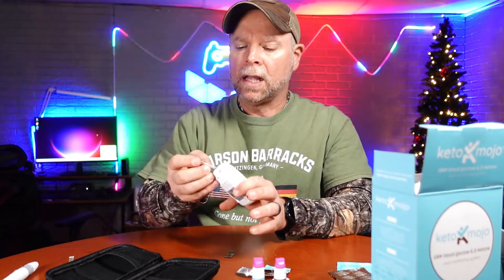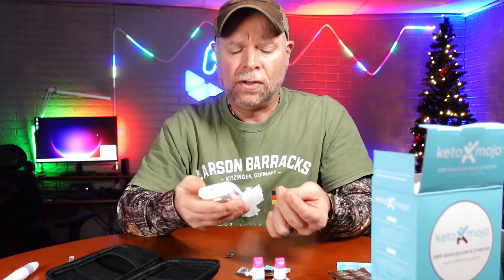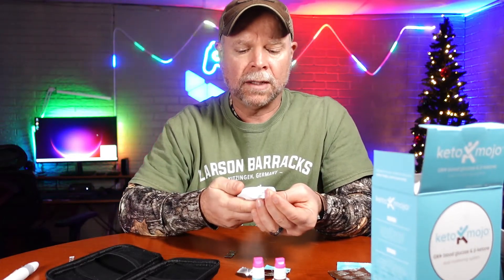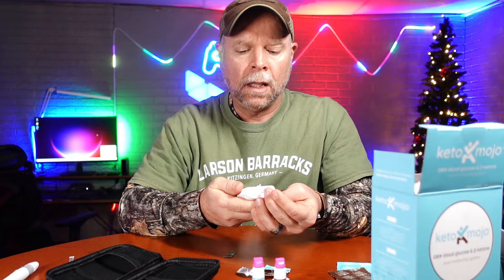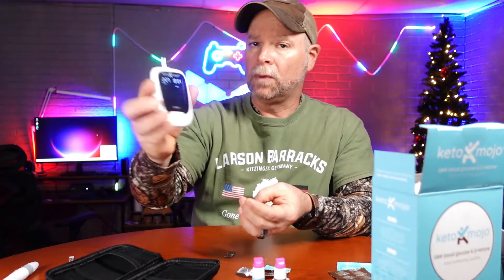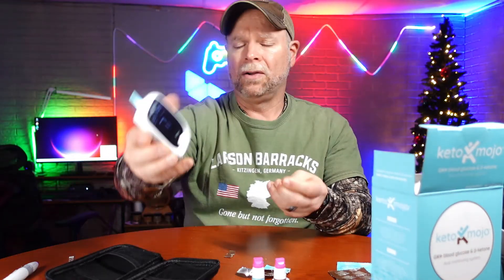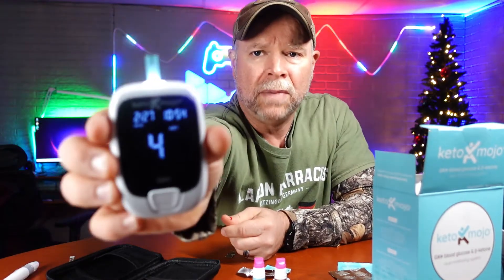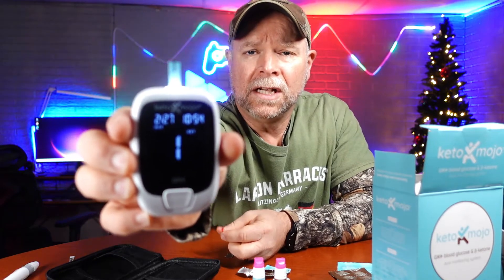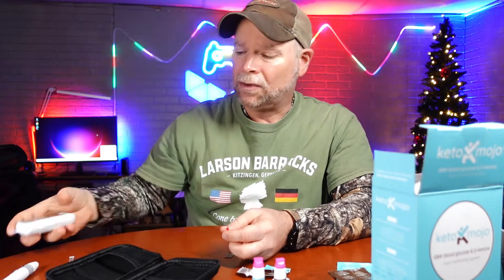Now my ketones should be fair. I've been on a good fast running right at about 16 hours, so I'm just going to use that same blood. It beeps when it gets the reading and that's going to take about 10 seconds as well. I got a 0.6 ketone reading, which is average for me.